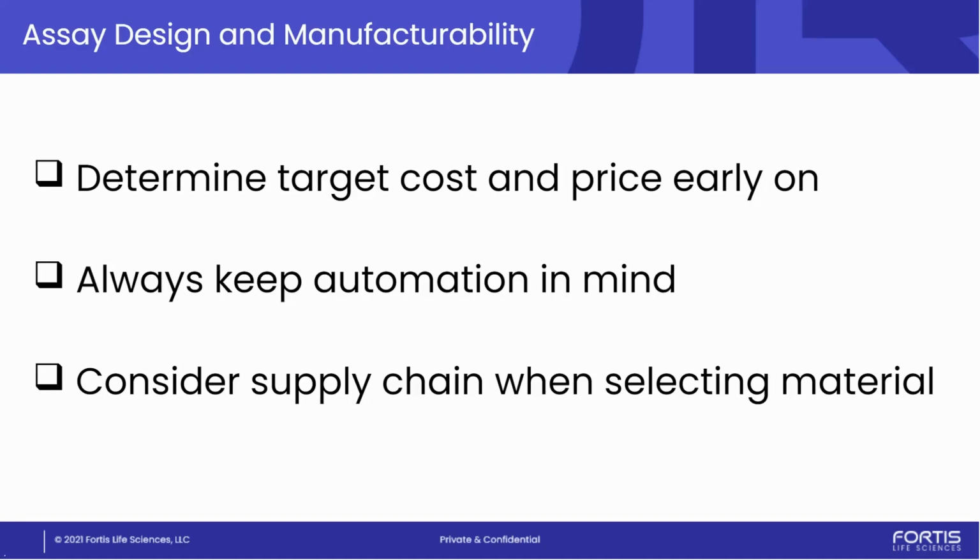And like always, consider your supply chain. Don't get bogged down with suppliers that you can't control or have long lead times. This is a consideration that many forget until the last moment, and it is something that should be considered.